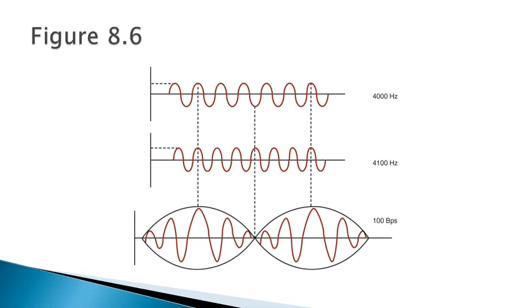You also want to make sure that the channels cross each other. So you actually want to crisscross the pads, crisscross the channels, and that gives you your resultant effect with the interferential stim.